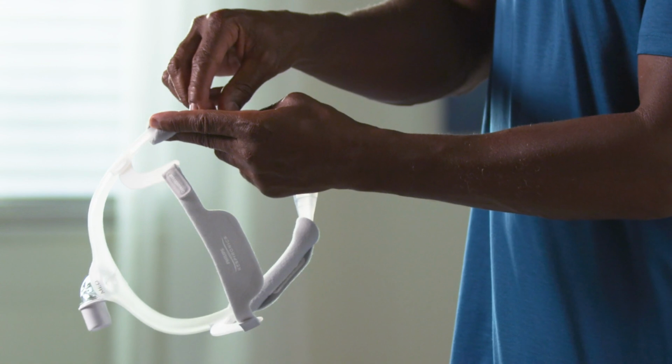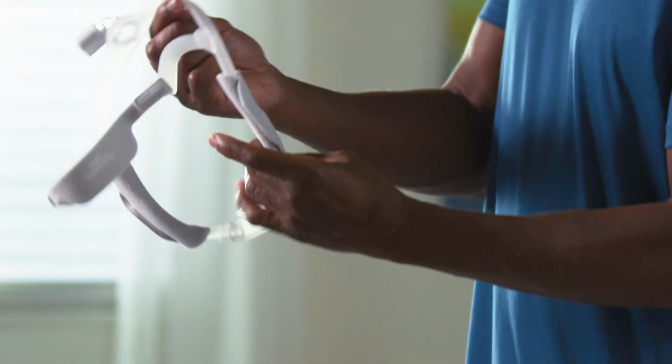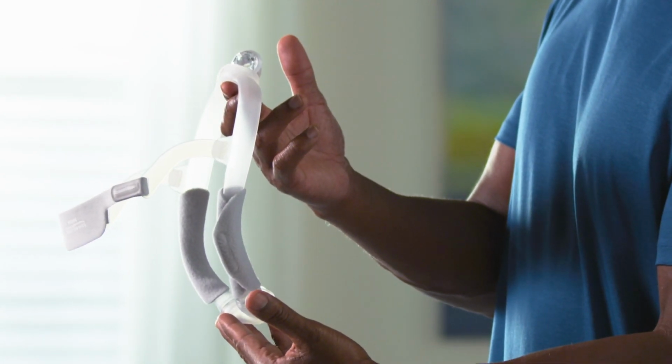You have the option of wrapping soft fleece sleeves around the sides of the frame for added comfort. Position the seams on the outside away from your face.